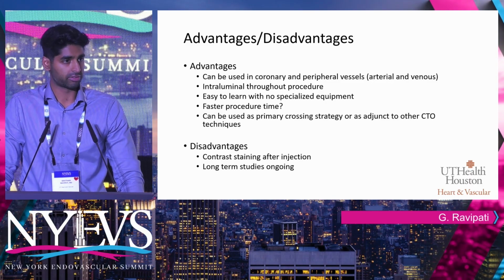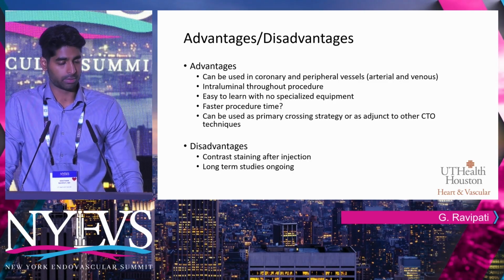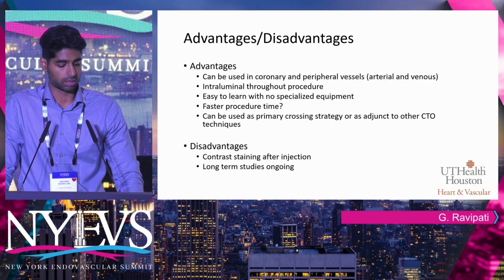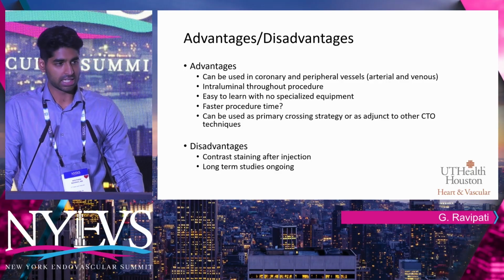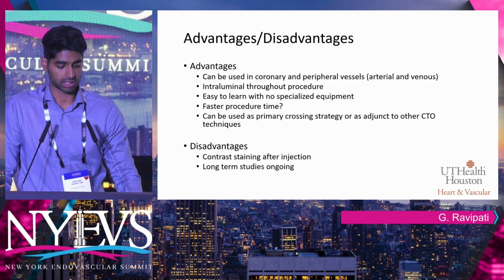At least anecdotally from our institution, we have had faster procedure times compared to the traditional wire escalation approaches or subintimal approaches. And again, even though we use it as a primary crossing strategy, for any CTO operator, it can be used as an adjunct to the rest of their CTO techniques.